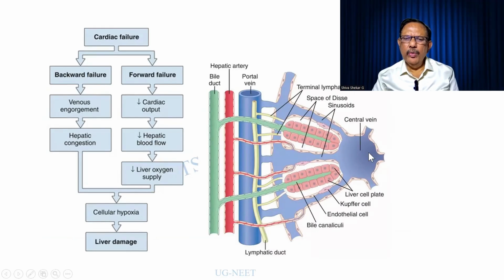So this is the liver over here. You should remember that there is a central vein, radiating cords of hepatocytes and the portal triad. From the central vein, the veins lead to it and it will be going into the inferior vena cava. The portal triad is over here.